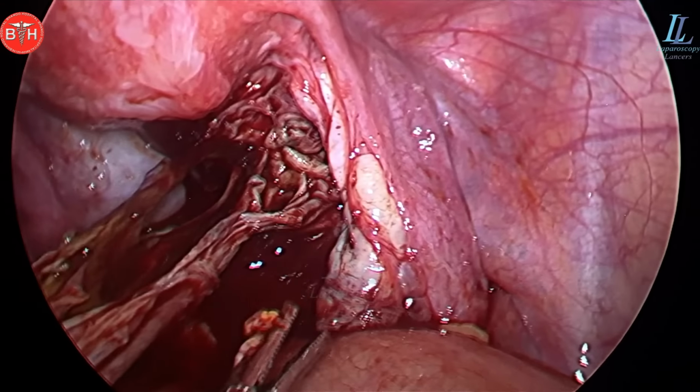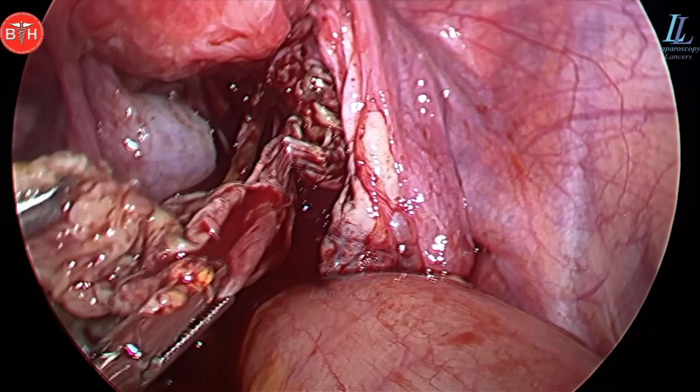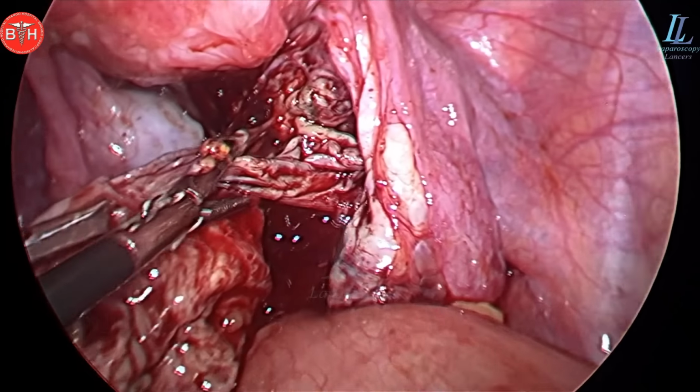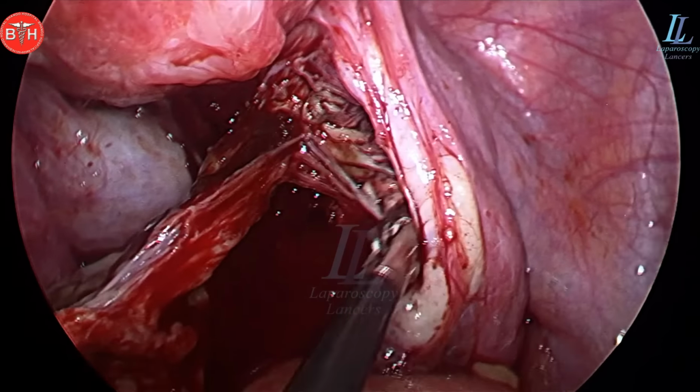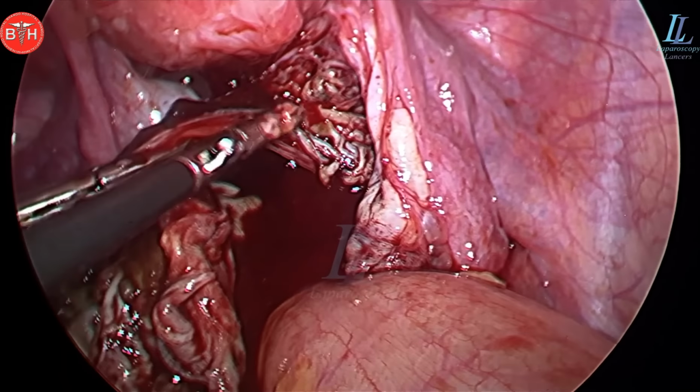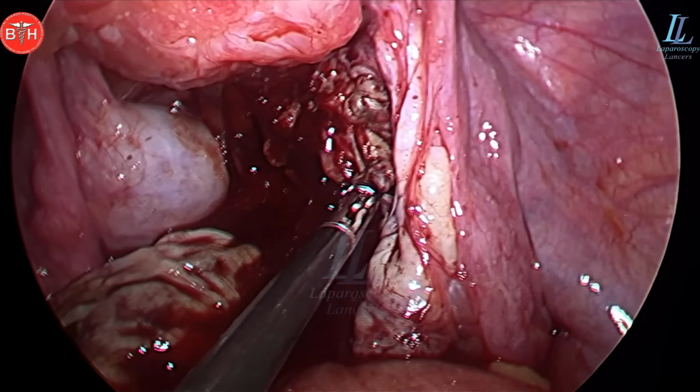So step by step, there the dissection is complete on the right side almost. I have inspected everything, and there you can see the endometriotic cyst has finally come out.